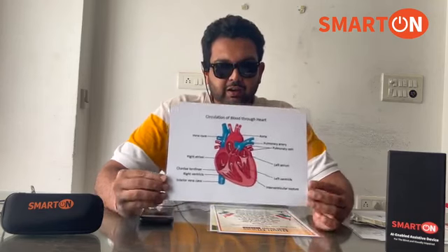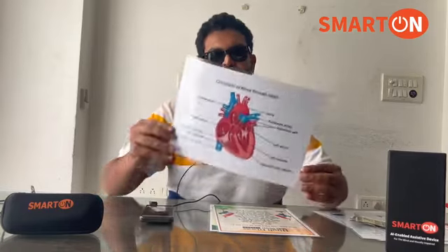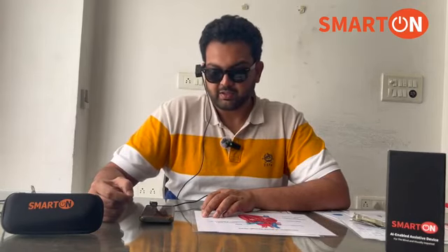Now I will demonstrate the Smart Eye feature's utility for accessing STEM content. I will show you how the Smart Eye feature will help you better understand this diagram, which is the circulation of blood flow in the heart. I'm going to show this image and let's see what the Smart Eye can produce. So I've selected the Smart Eye. I have five seconds to hold. 4, 3, 2, 1. Now it has taken the image. Let's see what the response is.